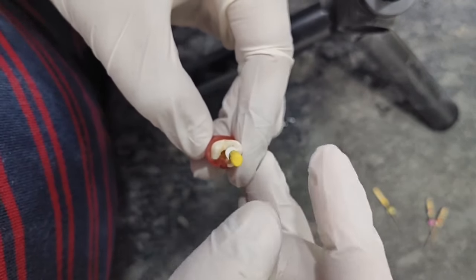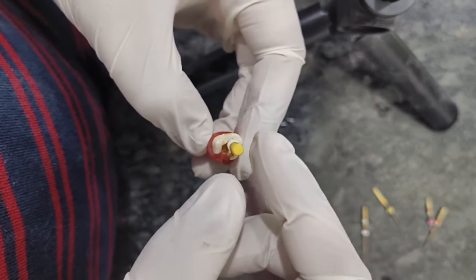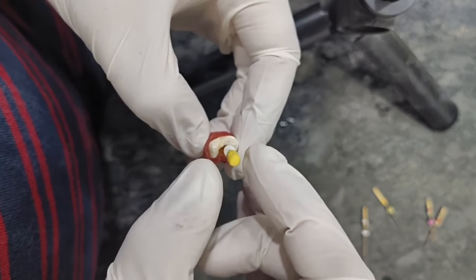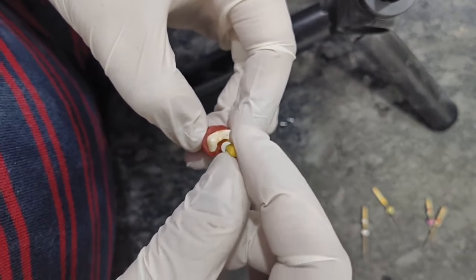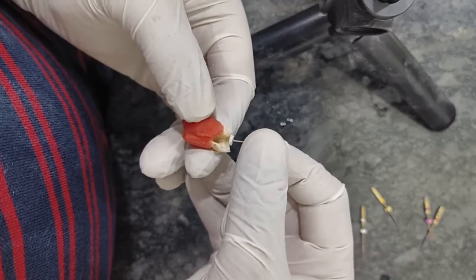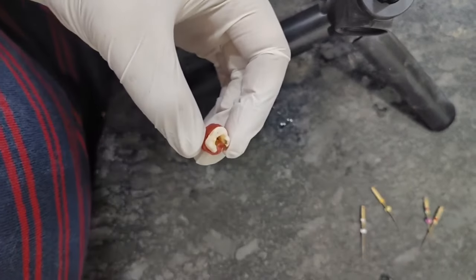So for all beginners, what I would like to suggest is, whenever you are doing the root canal of any particular molar or premolar or any anterior tooth also, start with the K files first, prepare till number 20, then only you introduce your rotary system. So this is freely going inside the canal, I will show you laterally, it is freely going. So that means the canal has been prepared till number 20 file.